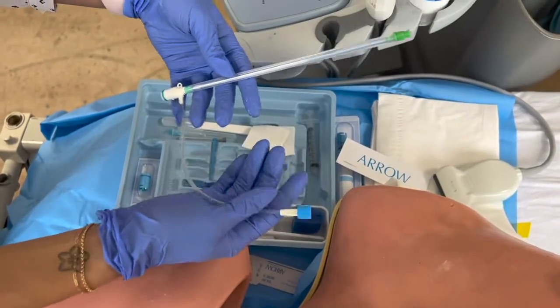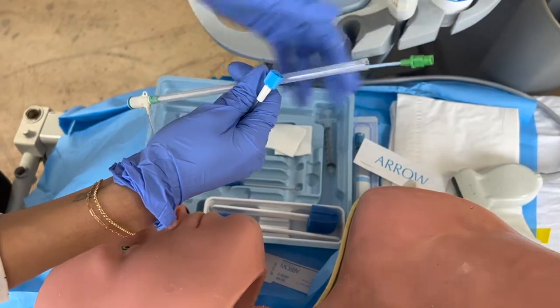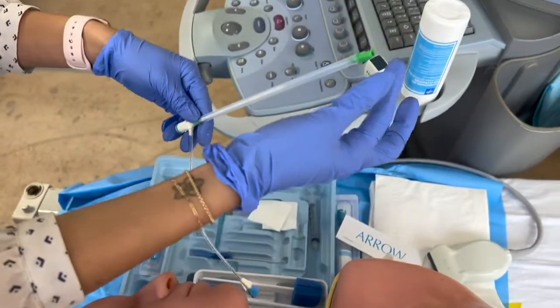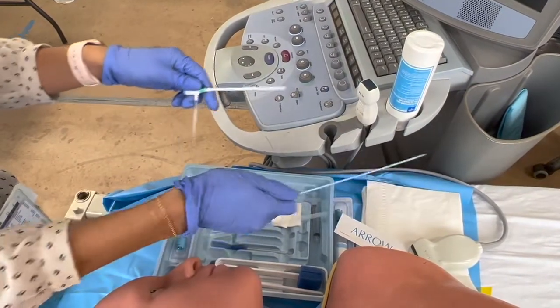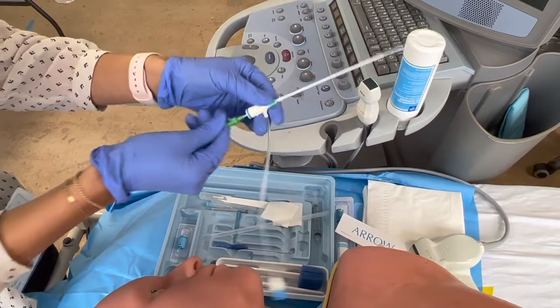The key here is that you don't drop this piece on the floor when you're taking it apart. This is the trocar plus dilator that it comes with. It comes like this, so the first thing you want to do is hold the green thing and take this out, then take this out of the sheath, and then put this inside the cordis — and that's ready.